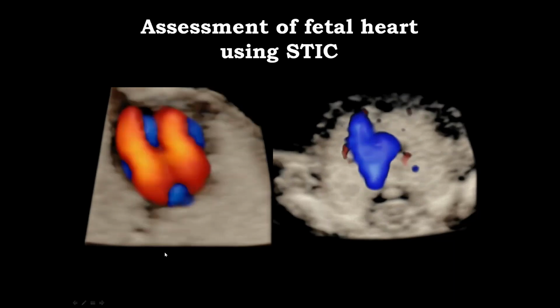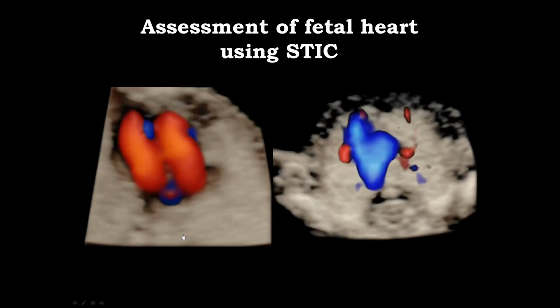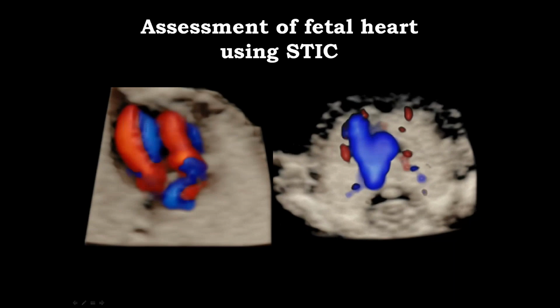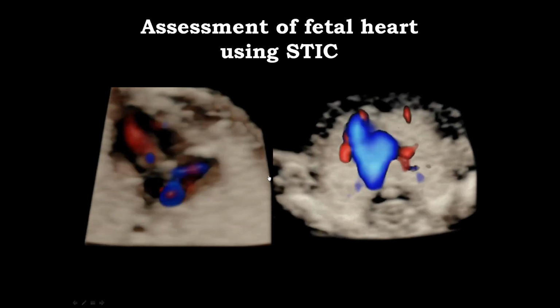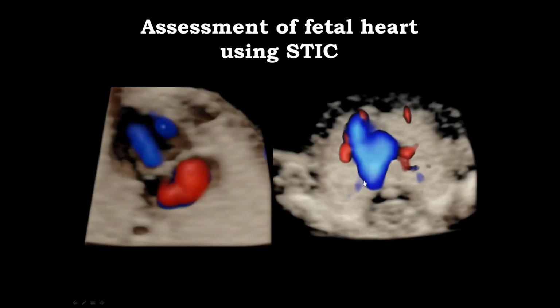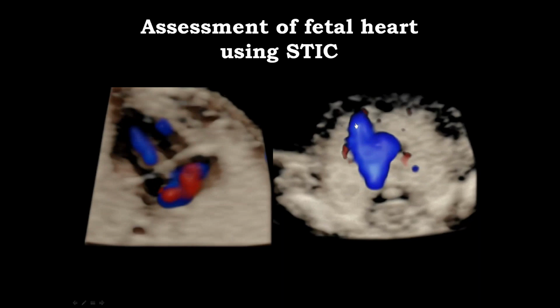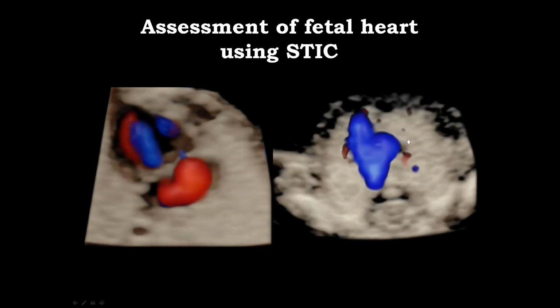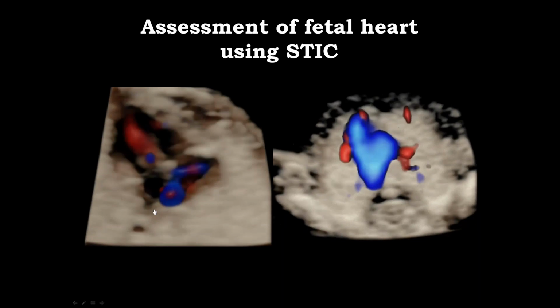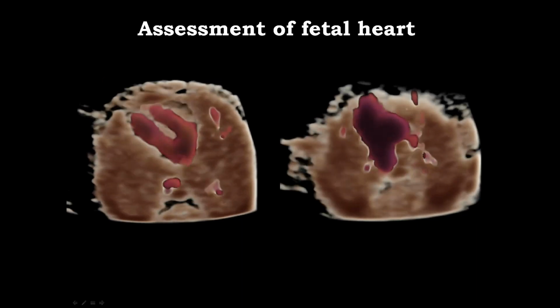And a few slides just to show how the new technologies can be helpful in detailed evaluation of the fetal heart. So here we can see the STIC technology allowing us to see the heart in 3D and using color. And here we have our favorite three-vessel and trachea view, and the resolution is so good that here we even can see the internal thoracic arteries that are running on each side of the thymus, allowing us to confirm that it looks normal on this fetus. Also, we can use the setting to let the system demonstrate a specific part of the heart. And here we are focusing on the interventricular septum, which is very clearly visualized here and appears intact.